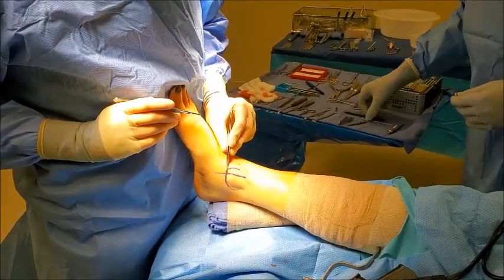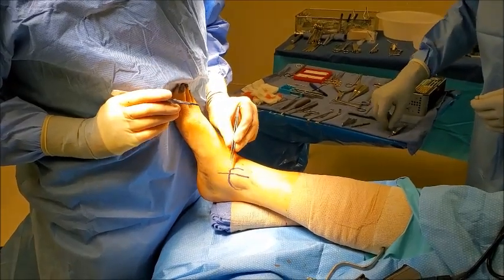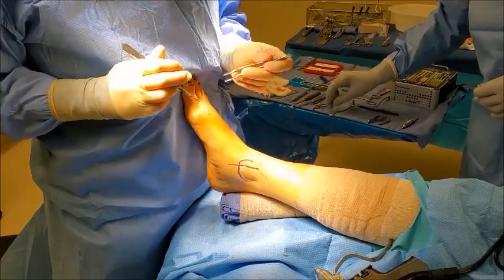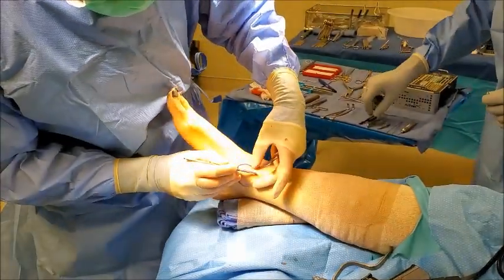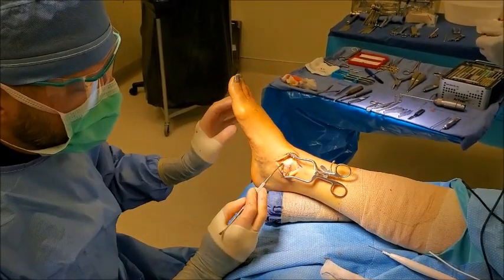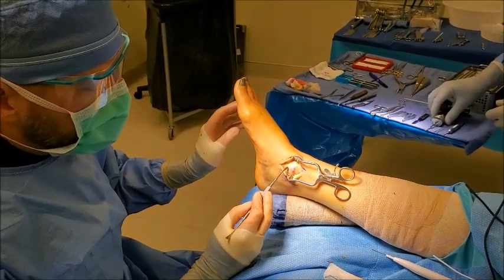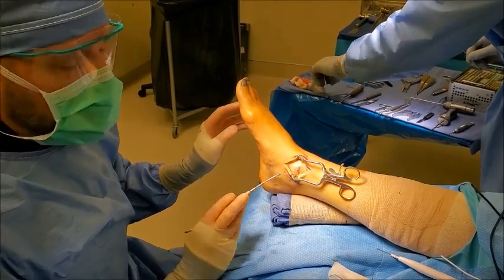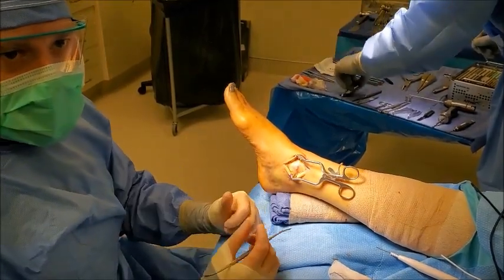At this portion of the procedure, we'll be fixating the medial malleolar fracture. It'll be one or two small screws that go across this to hold that fracture together. We've exposed the medial malleolus here, and we'll be removing some of the periosteum to expose the underlying bone, then putting one or two small screws across that to help hold that fracture site together.